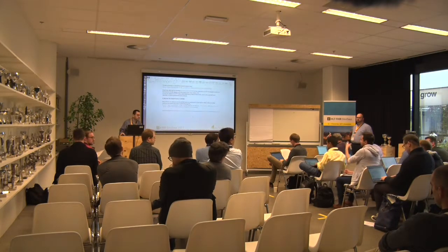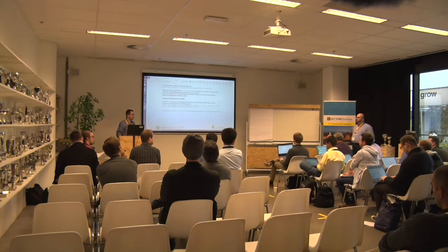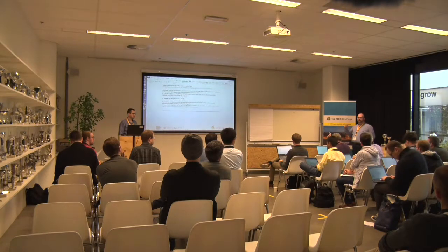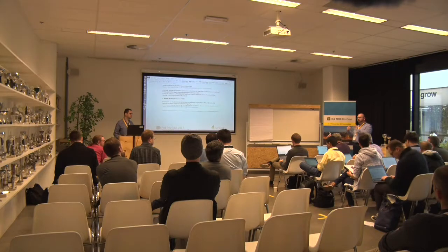Is there any reference from the DICOM server to the FHIR server? Are you storing some URLs in the DICOM server? No, not easily. You could look by patient ID and things like that. Do you know of a better link, Rob? No, you could use the identifiers to link back and query in FHIR again, but there isn't a way to say, here's the FHIR server that you pulled the DICOM from. Because you think about DICOM, they're all files on disk, and usually there's a relational database to help index these sorts of things, but they're mainly files.